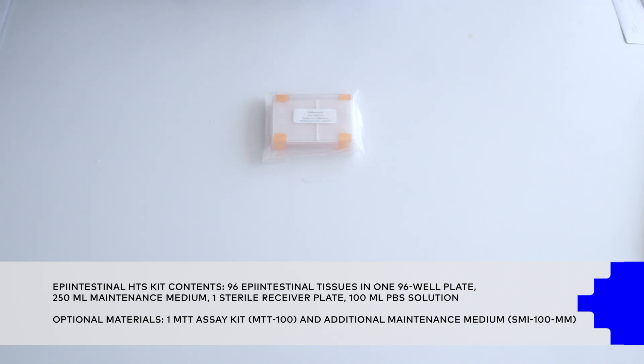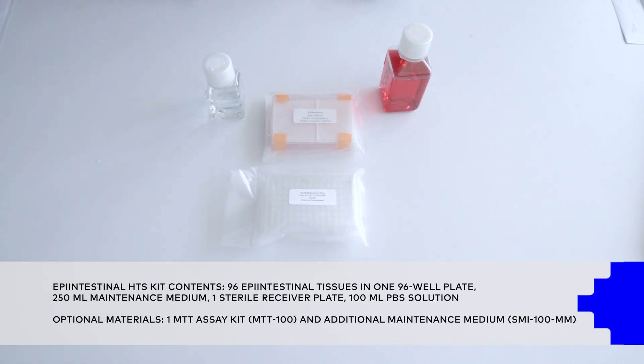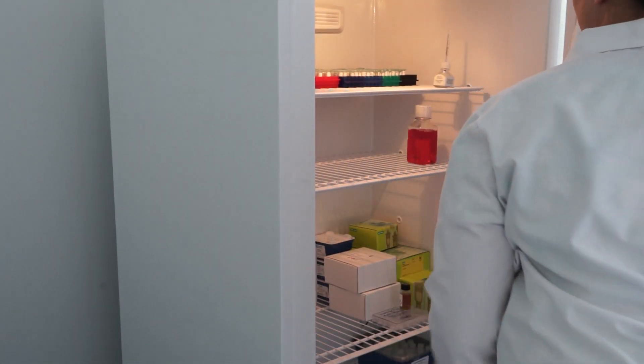The Epi-Intestinal tissues can be stored at room temperature between 20 and 25 degrees Celsius until you are ready to use them. Place the assay medium in the refrigerator, maintaining between 2 and 8 degrees Celsius.